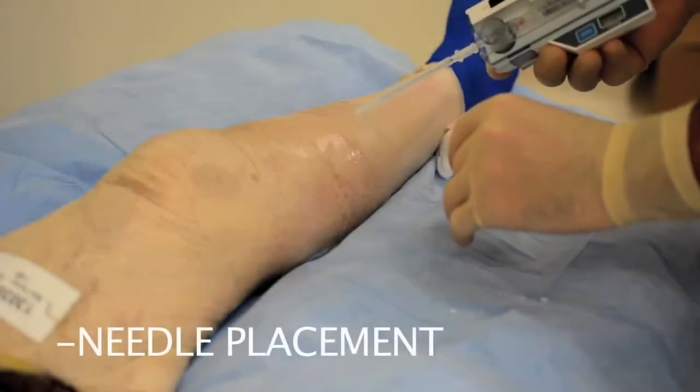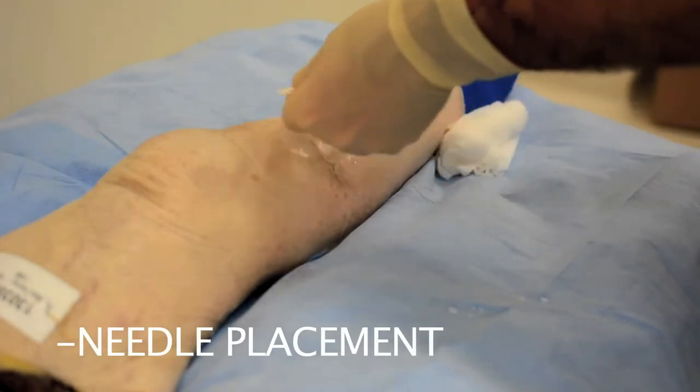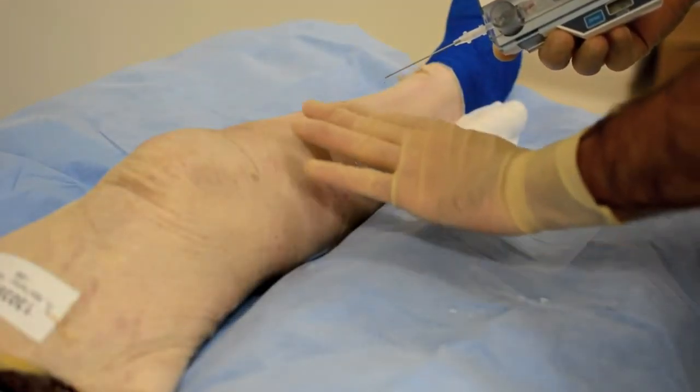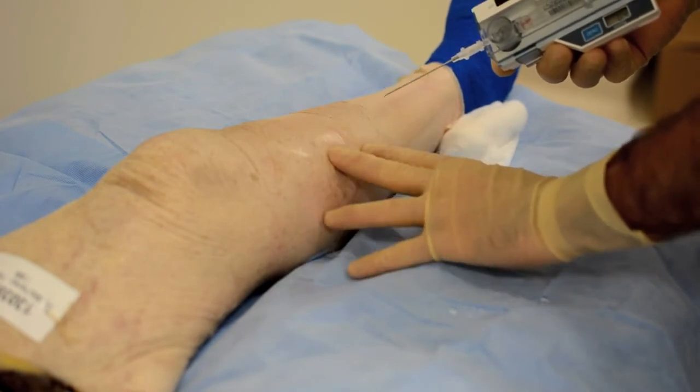The next step is placement of the needle into the compartment. With your sterile hand, you will remove the needle covering. You have already prepped this area out. You will palpate the compartment. You tend to check first.